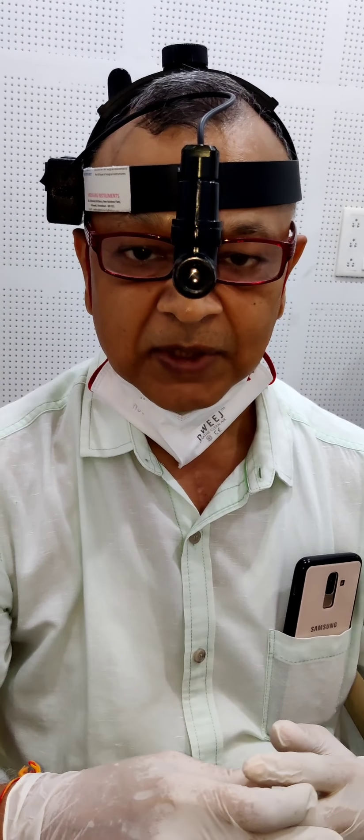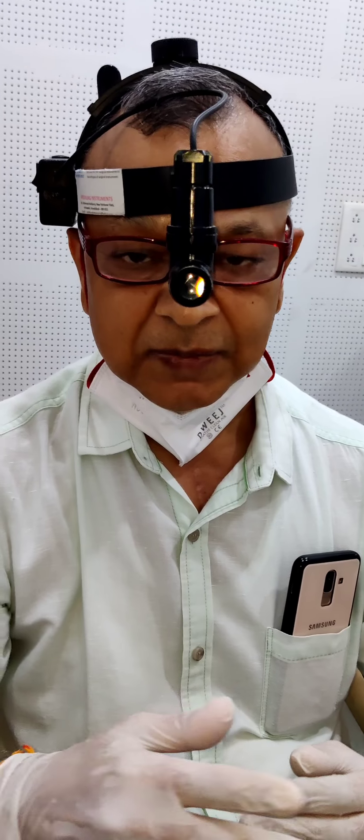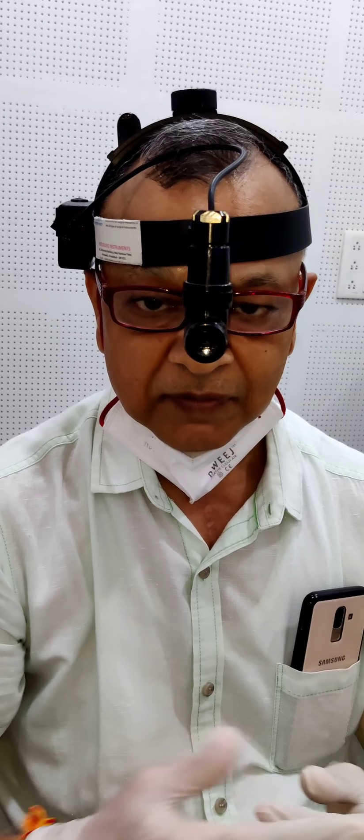I will repeat — the middle turbinate, inferior turbinate, middle meatus, and inferior meatus — these structures we can see. But in this particular patient, there is little hypertrophy of the inferior turbinate, and that is not allowing us to see beyond the inferior turbinate.